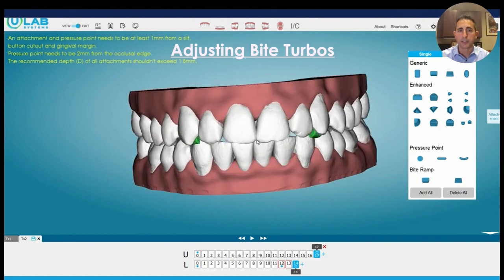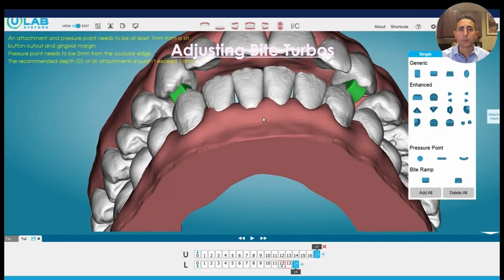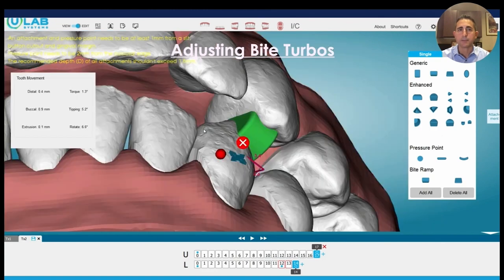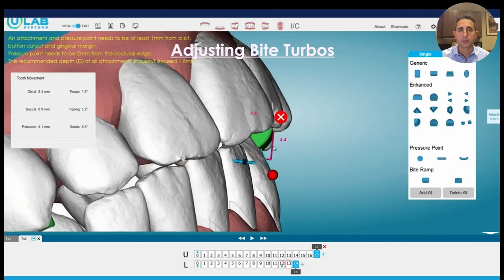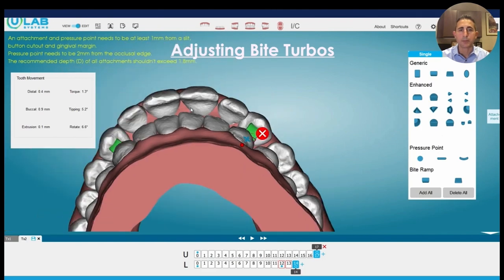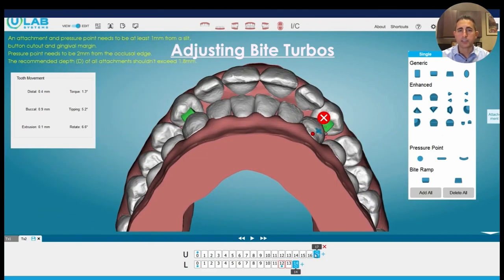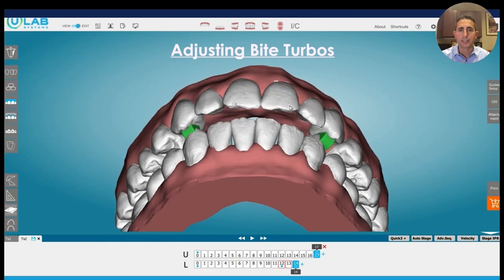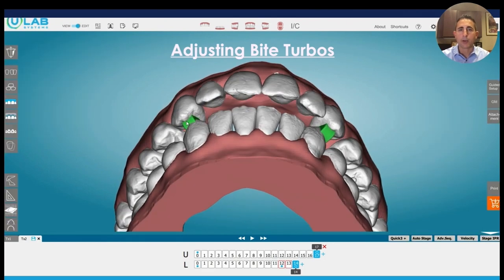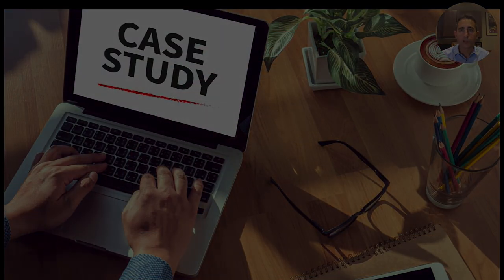Now we've moved those turbos and they're hitting on the canines. You can see very predictably there's going to be plenty of bulk there for those canines to be hitting. You can make them the size and shape that you want, then go ahead and move on and continue to make any other adjustments you feel are needed with this case. You can see again those turbos are hitting very well there.